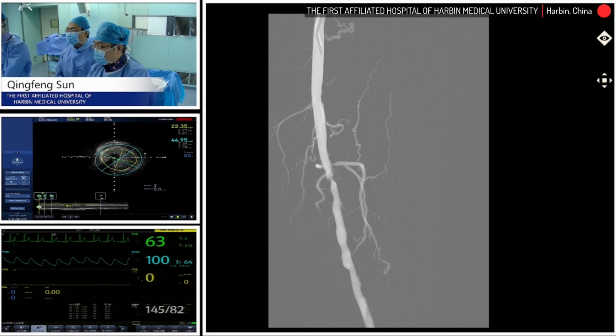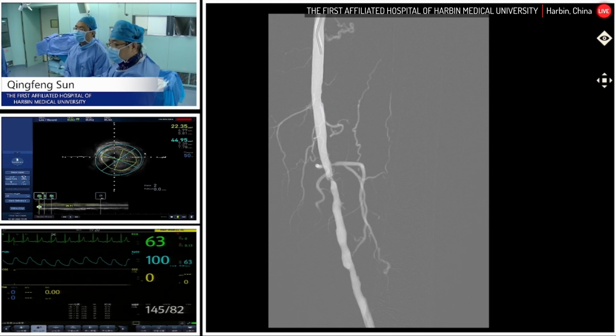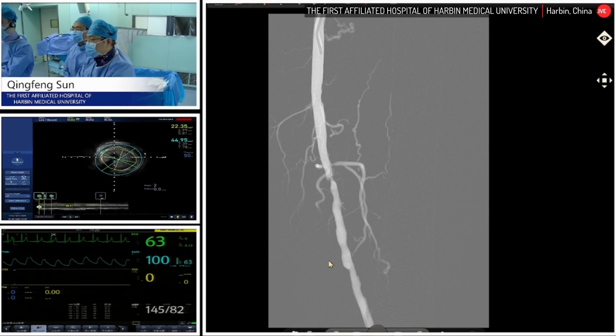Play it. Play. Number 10. We need number 10. Yes. Play. Yeah. There we go.